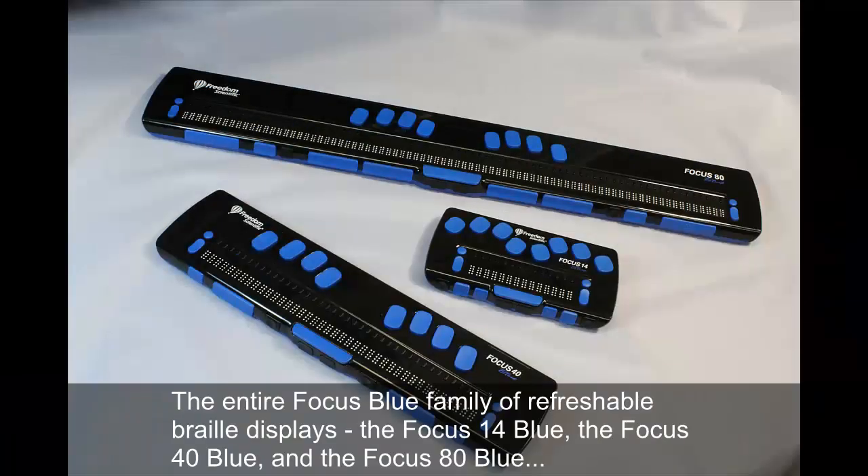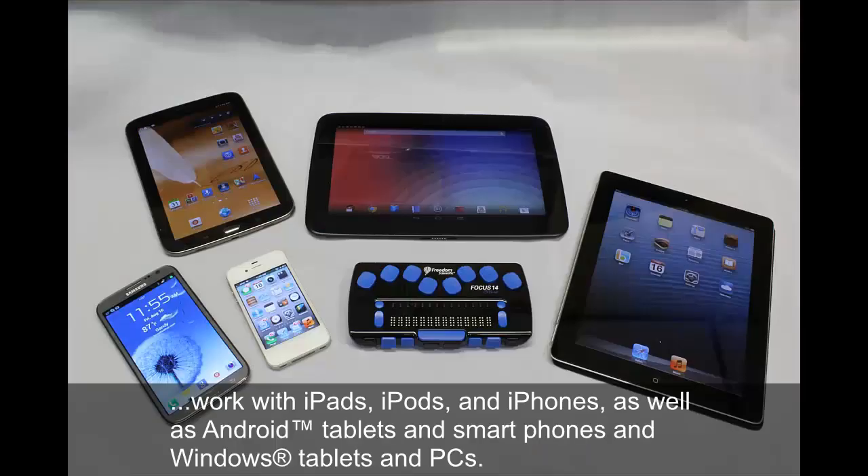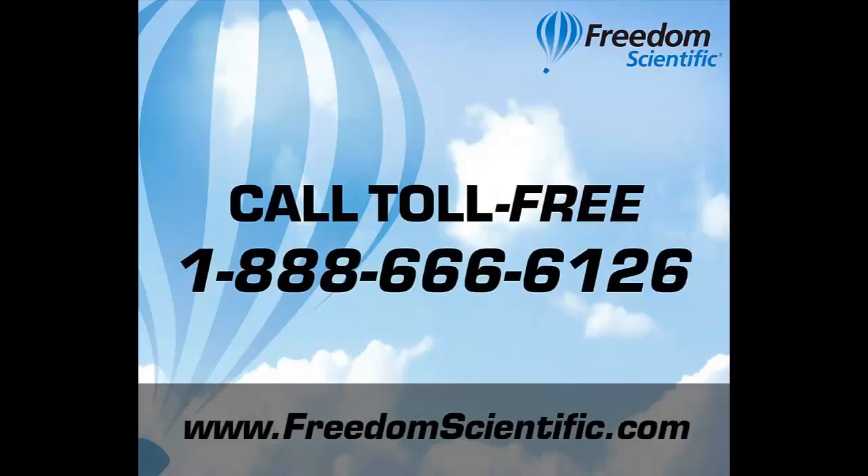The entire Focus Blue family of refreshable Braille displays — the Focus 14 Blue, the Focus 40 Blue, and the Focus 80 Blue — work with iPads, iPods, and iPhones, as well as Android tablets and smartphones, and Windows tablets and PCs. Call toll free 1-888-666-6126 or visit our website at www.FreedomScientific.com.